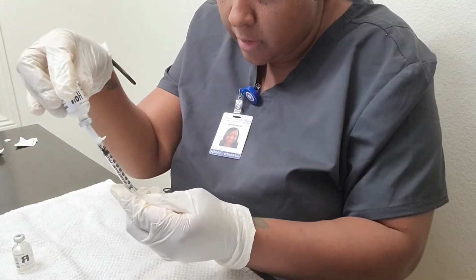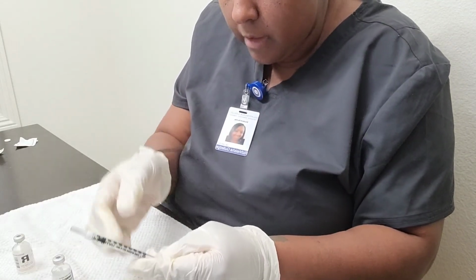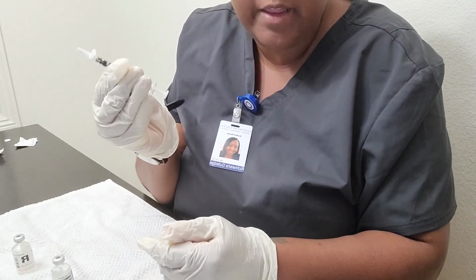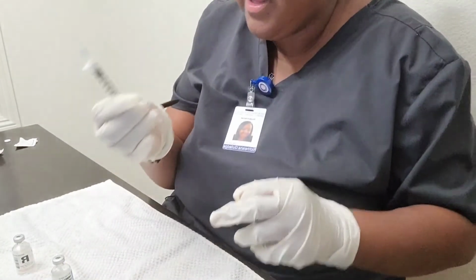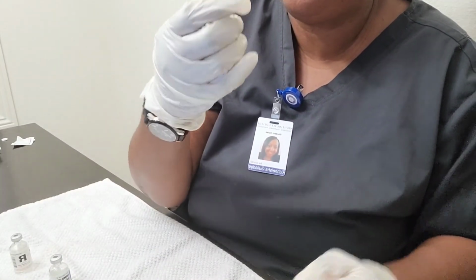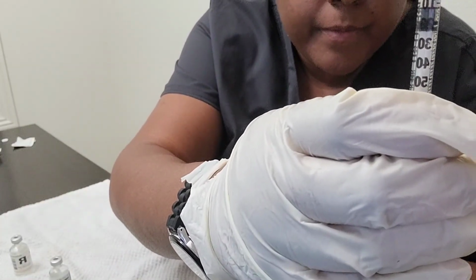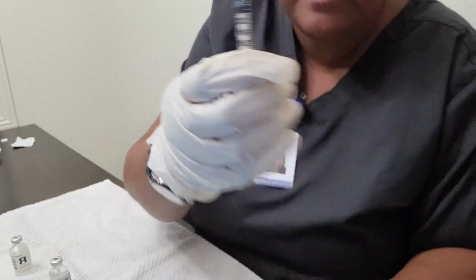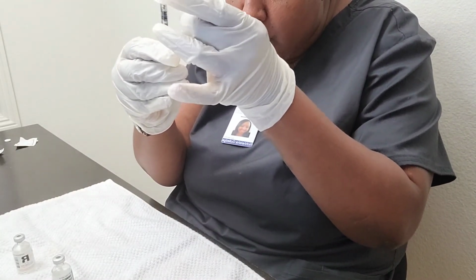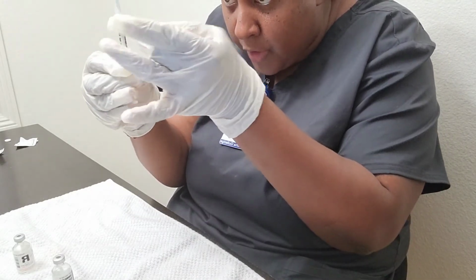And we're going to pull out, and we have a total of 12 units in the syringe. I will go ahead and tap it to remove any air bubbles, and I will do that each time that I remove the syringe.